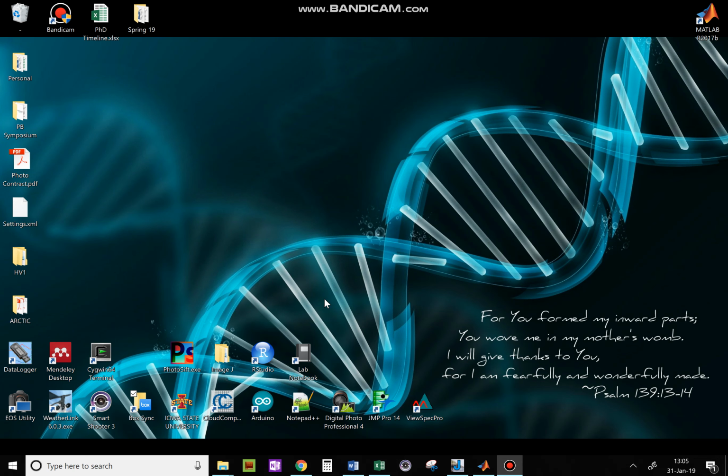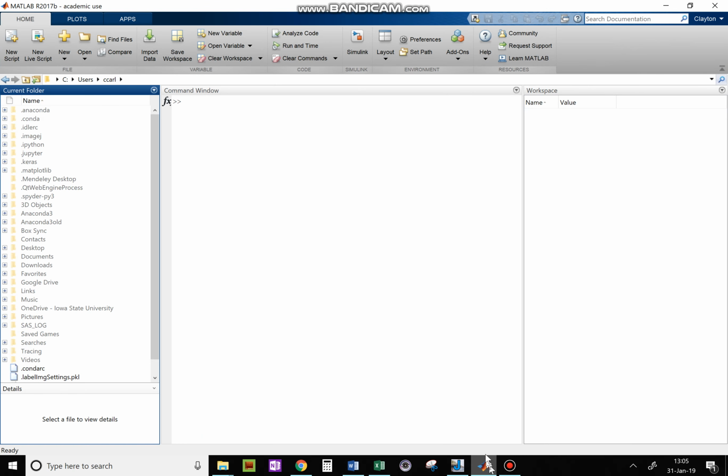So once you get your surface, the first thing you're going to do is go into the top right corner. I'll have Matlab ready to go up there. So you'll double click it and it will open up. Give it a little bit. It usually takes a while to fire up and gets the horses running. They're a little cold when they first get going.